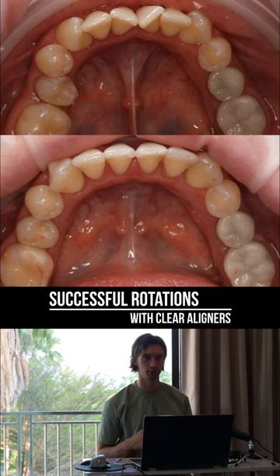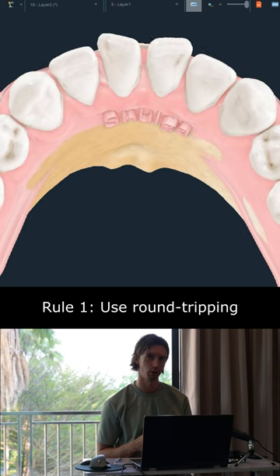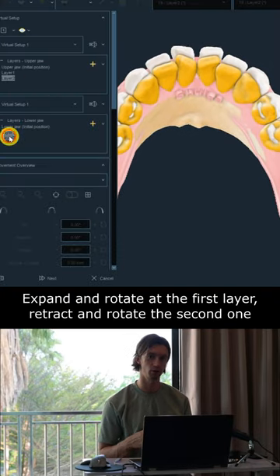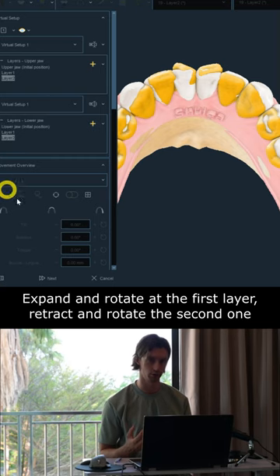The main clue to successful rotations with clear aligners is to use round tripping. You have to combine rotation with tipping. At the first layer, I expand and rotate, and at the second layer I retract and rotate.